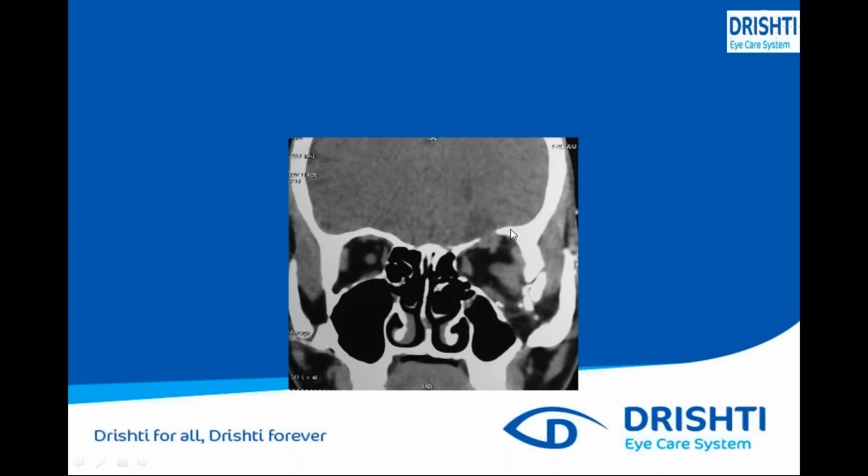Again, if you see here, this is the coronal cut, that was the axial cut. In this coronal cut, you can easily see there is the orbital fracture. Again, there are other multiple fractures. How do you see this one? This is the regular bony area, and here you can see the fracture. So this is the orbital bone fracture.